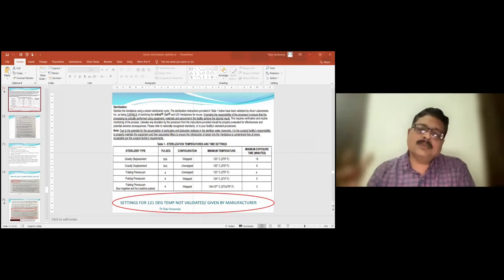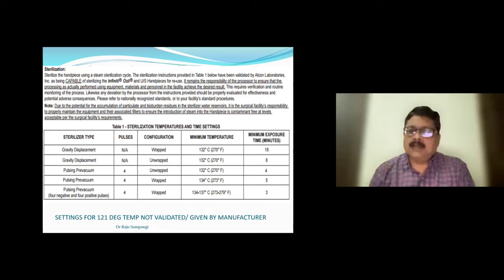So you have to monitor the process as much as you can and maintain documentation, as sir said, for your medico-legal aspects also. Second thing is infections are unpredictable. I have seen consultants operating for 30 years and then getting infections. It can happen to anyone. So if you suffer such an episode, you need to go back and be able to trace whether everything was okay. For that, you need detailed documentation. And as I mentioned previously, anything that goes into the eye is the first suspect: your IV fluids and your instruments, particularly cleaning and sterilization. So documenting these two things is going to be very important for preventing outbreaks and also for analyzing the cause of an outbreak.